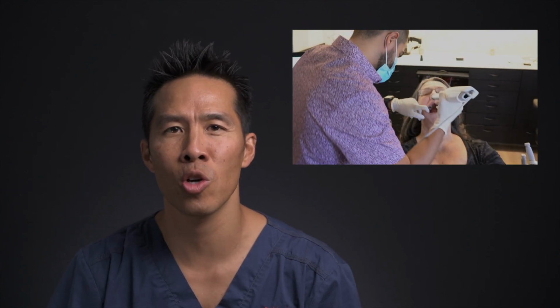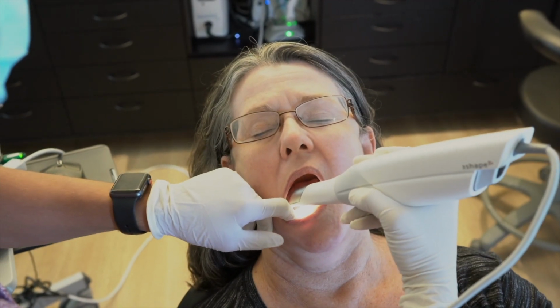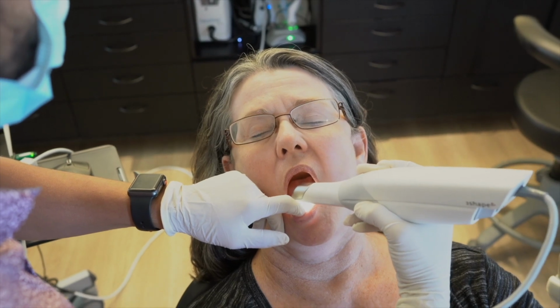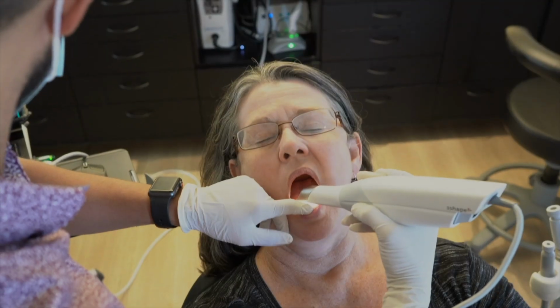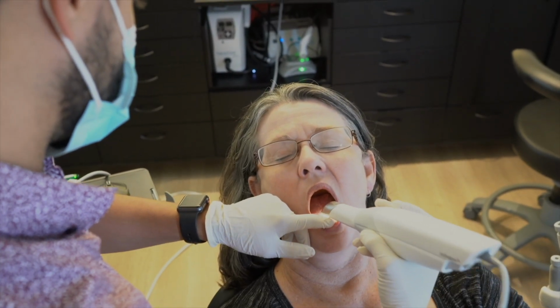The second technology that has come about is intraoral scanning, and intraoral scanning allows us to use this technology to take a copy of the patient's mouth, so a virtual copy of the patient's mouth, and this decreases the need or eliminates the need to take impressions. And we all know that patients actually hate having impressions taken because of course the putty has to go in the mouth and actually set.